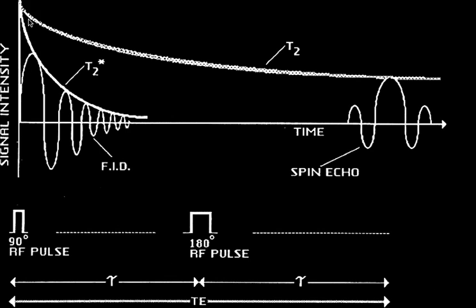Now, the T2 star value: if you initially give the 90-degree pulse and you put an oscilloscope on the wire that's coming from your receiver coil, what you will see will be signal variation. You will see a signal here with a frequency that at 1.5 T would be about 64 megahertz, 64 million times a second. So we'd see this wiggle here and it would drop off very rapidly, typically within a couple of milliseconds. There are two components causing that. One is the drop off from the T2, which is the time varying inhomogeneities.